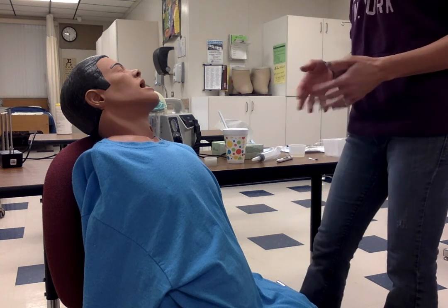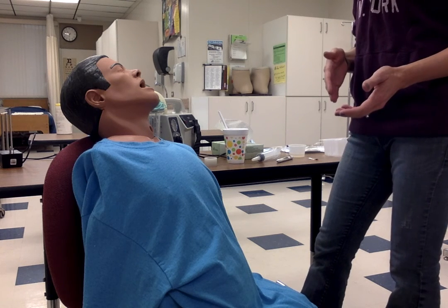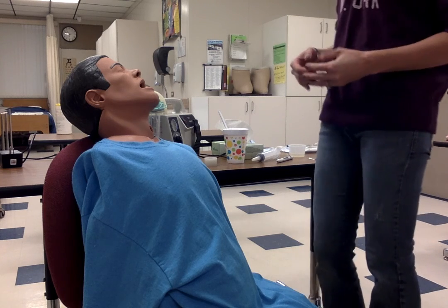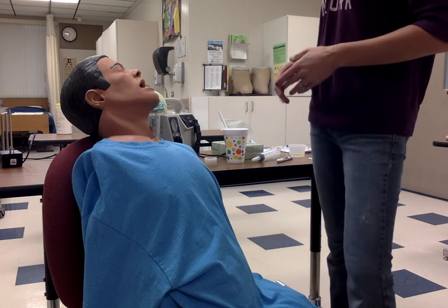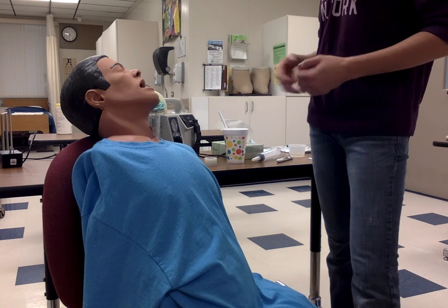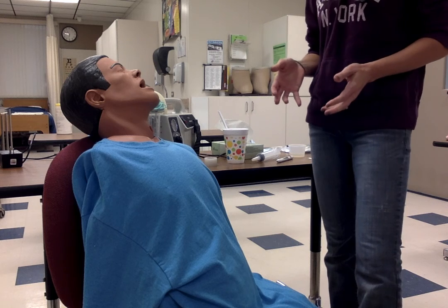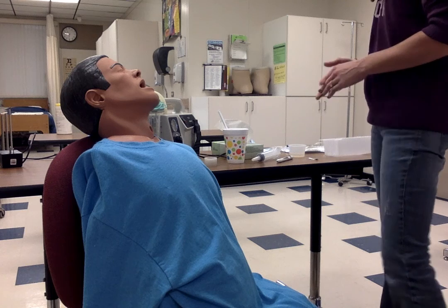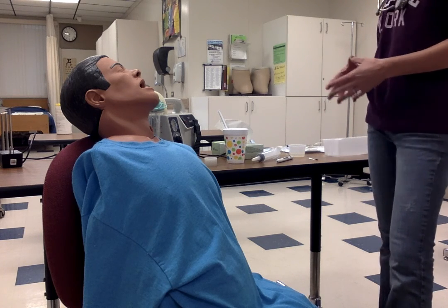Education's a big thing. You want to explain that yes, it's uncomfortable, but hopefully your symptoms should be relieved by this. So the patient has decided that yes, this is something he would like, so he has given me the okay to go ahead and insert the NG tube. So with that being said, I would then go ahead and get all my supplies. I would need a bunch of different things. So for this recording, I did go ahead and collect my supplies ahead of time. So I have the proper supplies that I would need here.